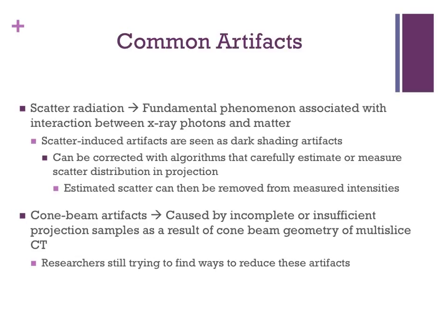Cone beam artifact is complicated, so we won't get into it in depth here. Cone beam artifacts are caused by incomplete or insufficient projection samples as a result of the cone beam geometry of multi-slice CT.